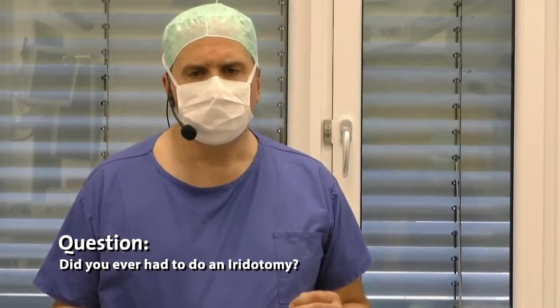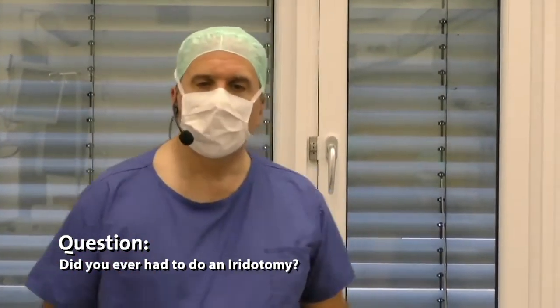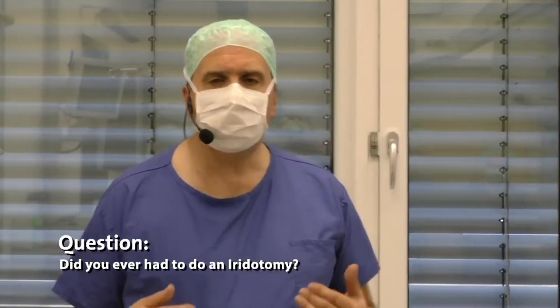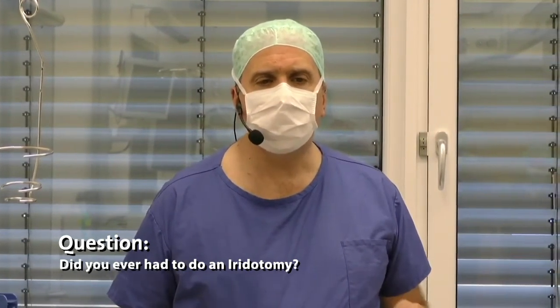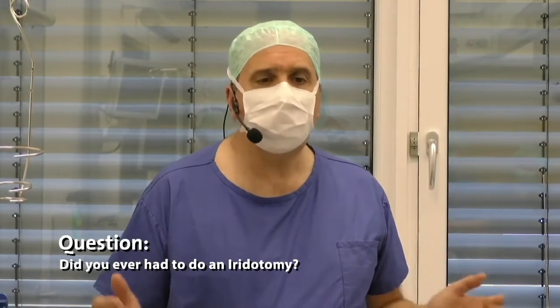Is there a need to do iridotomy? Yeah, also very good question. I probably forgot that. No, from my point of view, there is no way to have a pupillary block formation, even in the add-on system. I never ever did a peripheral iridectomy or iridotomy, and I never regretted it.